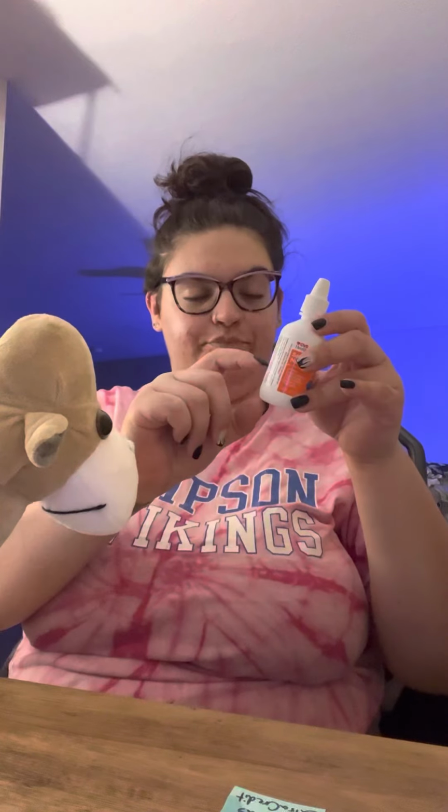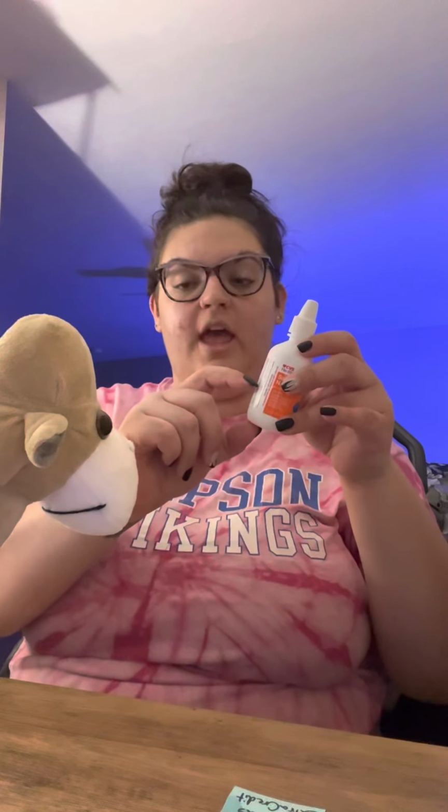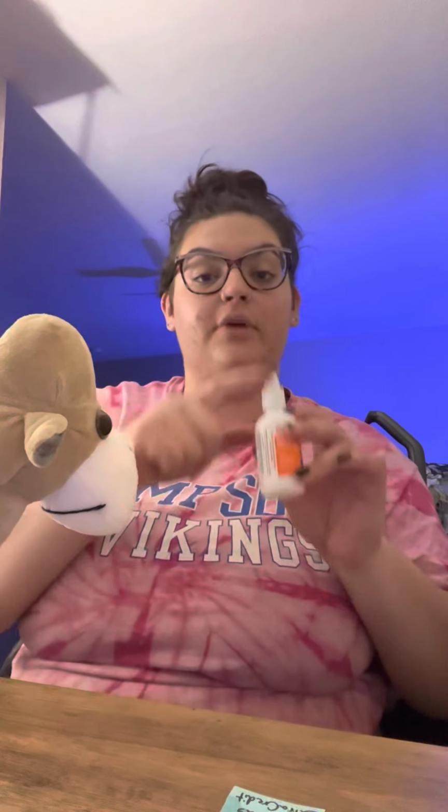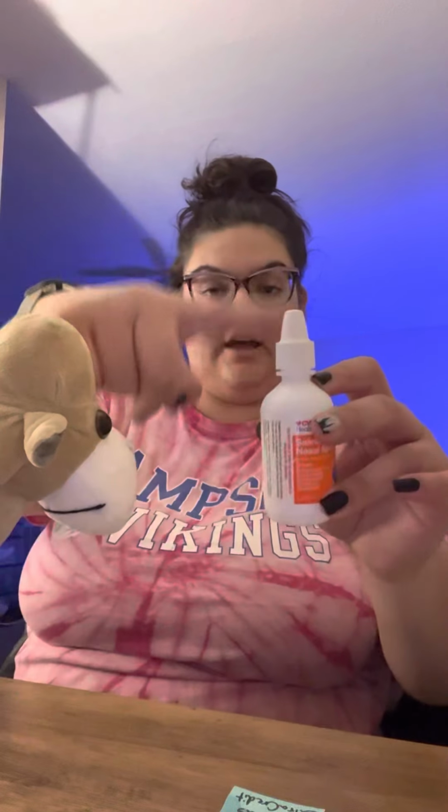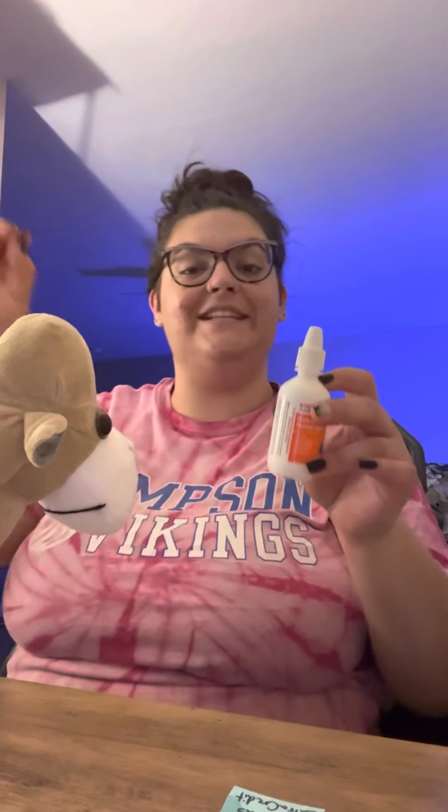I will then shake this for 8 to 10 seconds, explaining that it is time for him to get 2 pumps of his inhaler. And I will explain that he needs to close his mouth around the mouthpiece here and inhale simultaneously as he presses the inhaler button, this top button here. Simultaneously breathe in as the medication is being dispensed.